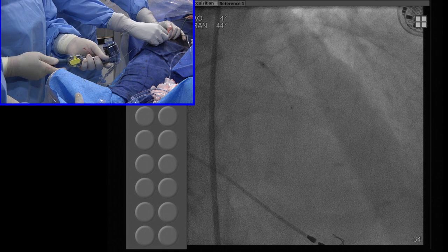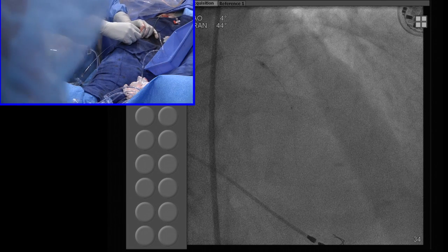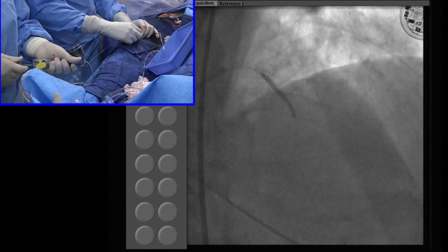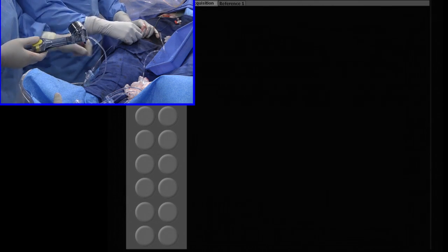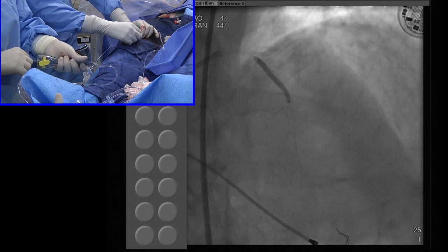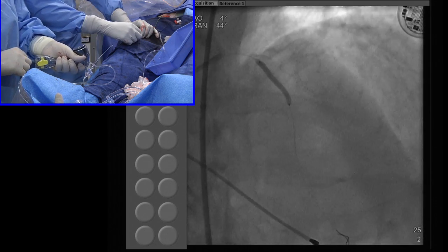Once the balloon is taken out, what's left are the platinum markers on the scaffold, which are more difficult to see, but not too hard to see when you get off the diaphragm or do stent boost. They're pretty easy to see. And the expansion has to be gradual. What Dr. Sharma is doing here is gradual inflation, 2 atmospheres every 5 seconds, up to 10 atmospheres.